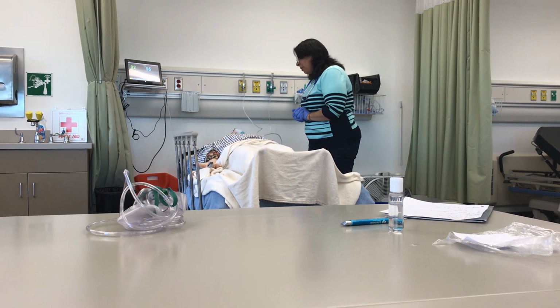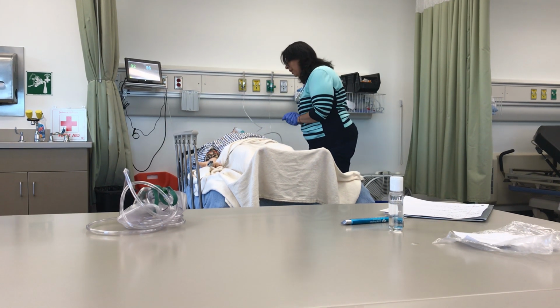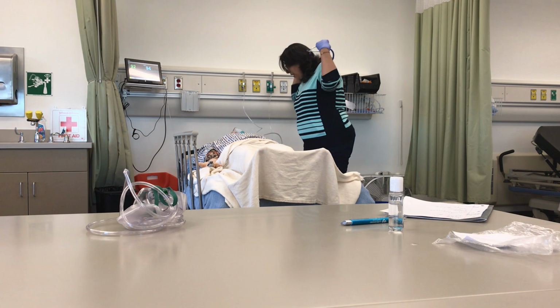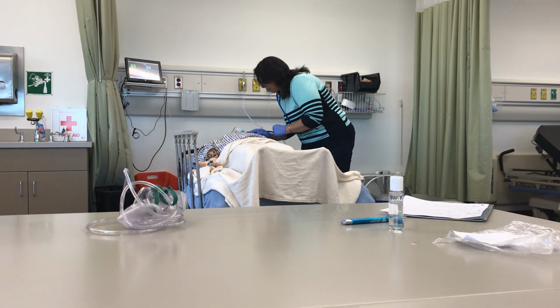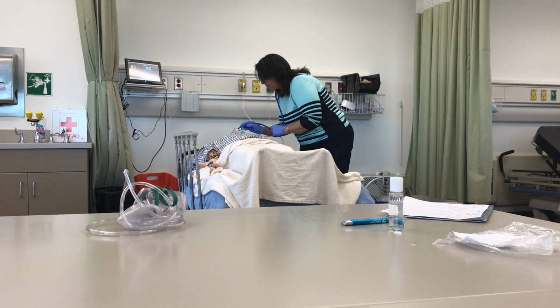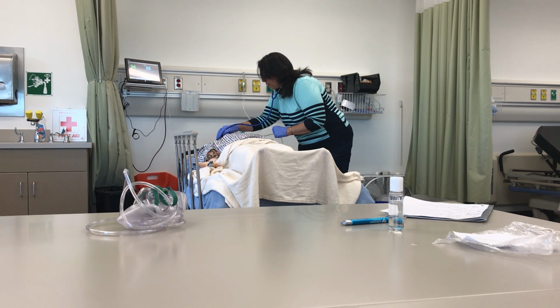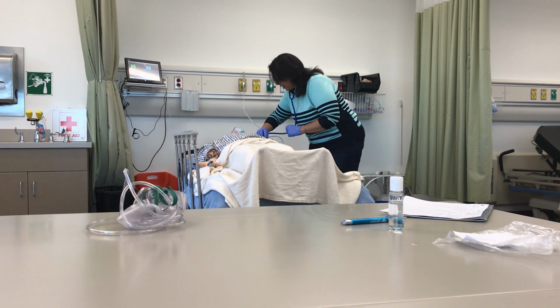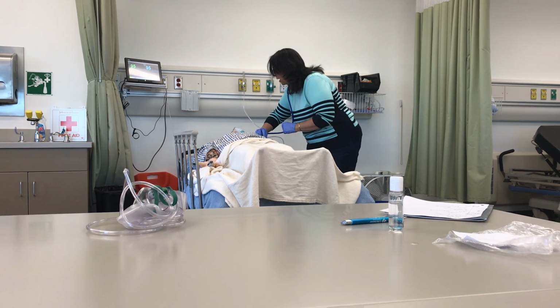And I'll ask Mr. Dumbledore, how are you feeling? I'm about 10 minutes into treatment, and I'm going to ask Mr. Dumbledore, how are you feeling right now? It's a little better. Okay, let me listen to your breath sounds and see what's happening. Oh, much better. I don't hear any wheezes. Sounds way better. How are you feeling right now? Better than when I started. Great.